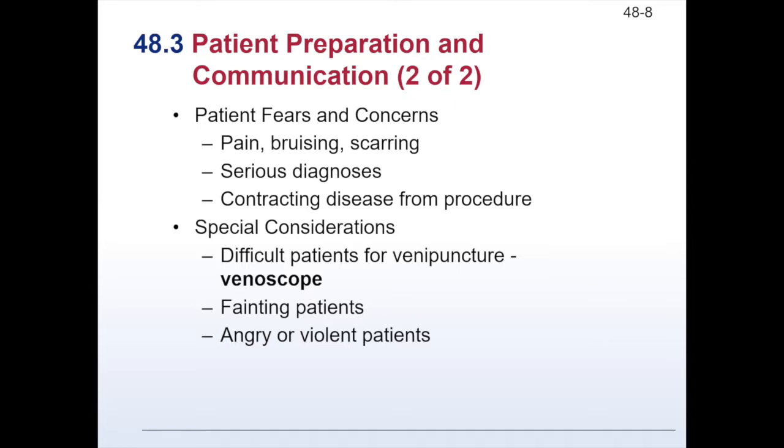Some patients will have a reaction and faint at the sight of blood. Most patients revive promptly, but don't leave a person alone. If there is a more severe reaction, such as a seizure during the blood draw, call for help but remain with the patient.